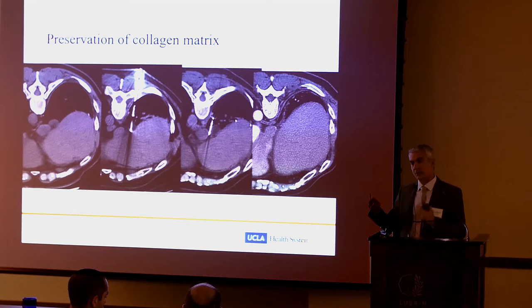This is basically how we did them. Only one cryoablation needed general anesthesia. You saw that image. Most of them were done under conscious sedation and local anesthesia. They were discharged home the same day. Mean age was 64, with patients from 48 to 82. Almost equal division, with slightly more male than female. This is the histology type: epithelioid, mixed, some sarcomatoid, and one case unknown. And staging, this is surgical staging again. We all anticipate going in at N0, N2, but sometimes it's more than that, and you can see some of the patients were at higher stages.